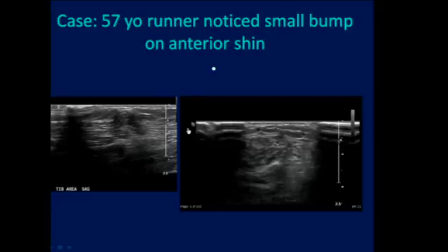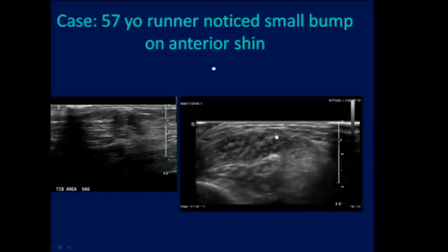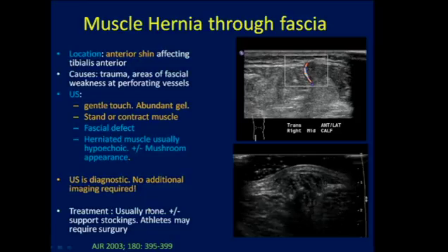This is a case of a 57-year-old runner who noticed a small bump on her anterior shin. This corresponds to the area of the bump. On real-time imaging, we can see that this lump actually represents muscle that's projecting through a defect in the fascia. This is someone with a muscle hernia through the anterior fascia. This typically occurs on the anterior portion of the shin, affecting the tibialis anterior. It may be caused by trauma or just areas of fascial weakness, such as here where we see a perforating vessel, and right next to it we have this little lump.